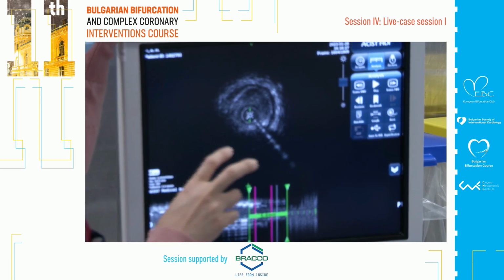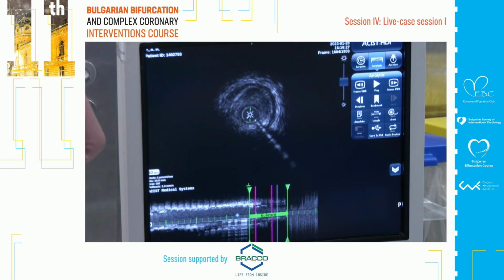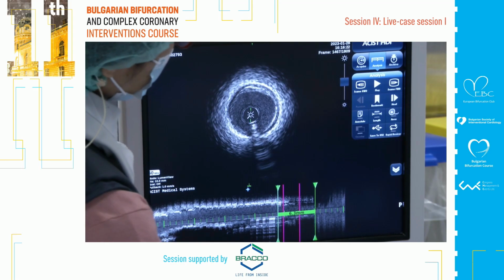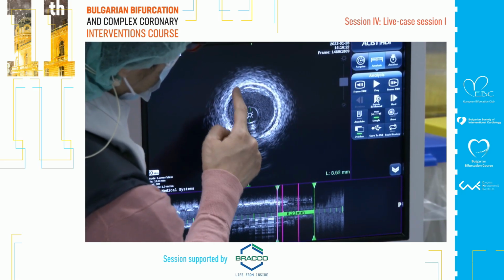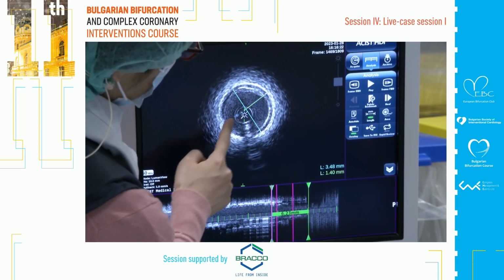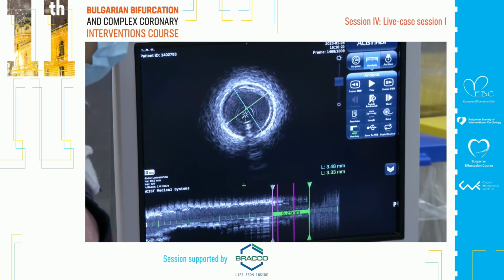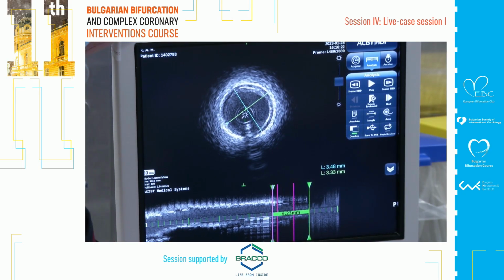So to me, this is significant in relation to the angio, but I worry how much spasm affects these findings. But this angio is done after we inserted some. Okay. If so, I think we consider this significant. And if you go to the distal measurement, media to media is about 3.4, and this one is also 3.3, and maybe 3.0 is a good one. And from here to a little bit outside is only 6 millimeter. So even 8 millimeter or 12, that's a good number. I think there's a 3.0 by 9 or by 8 something.